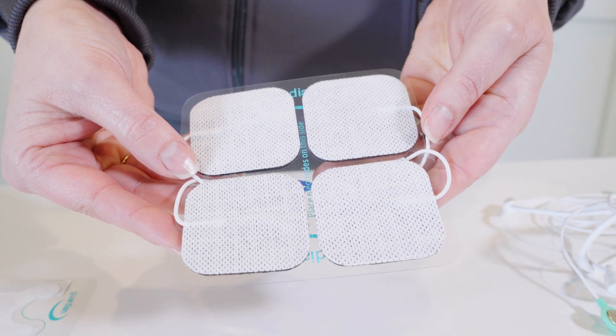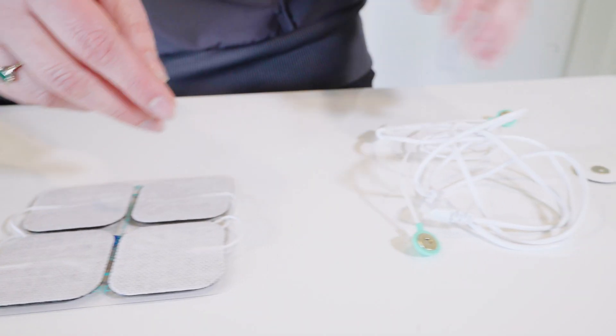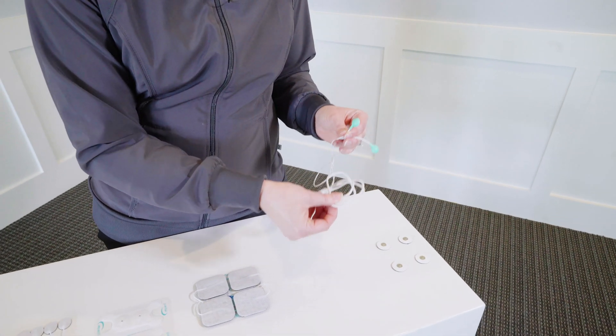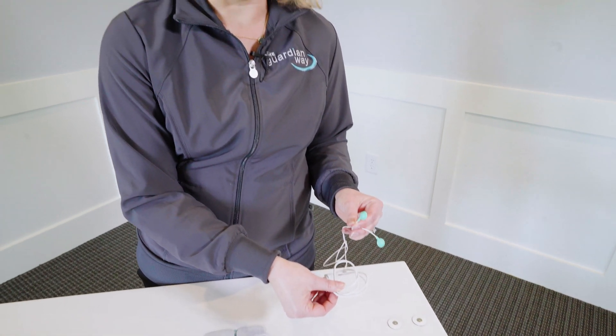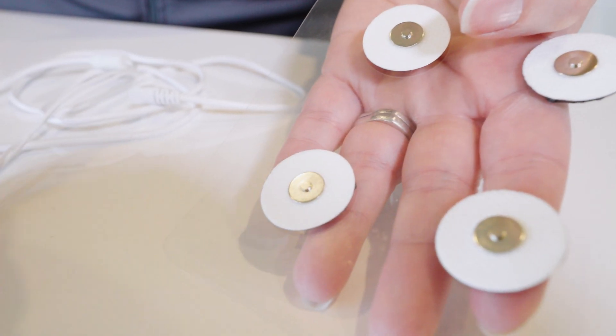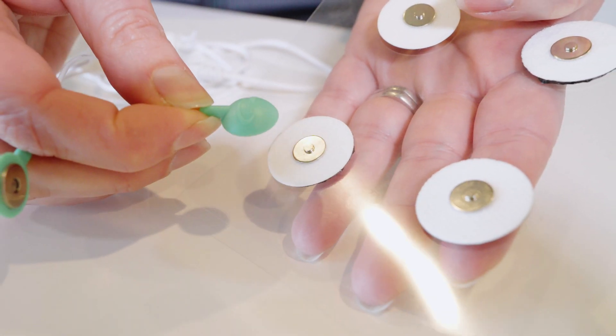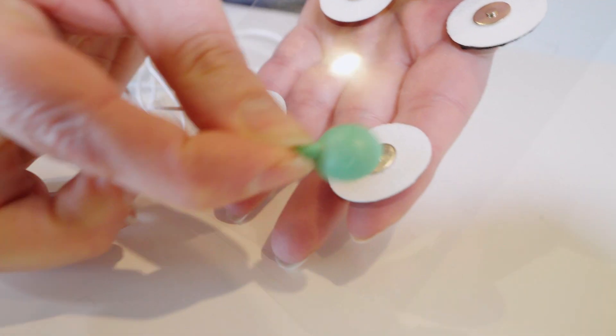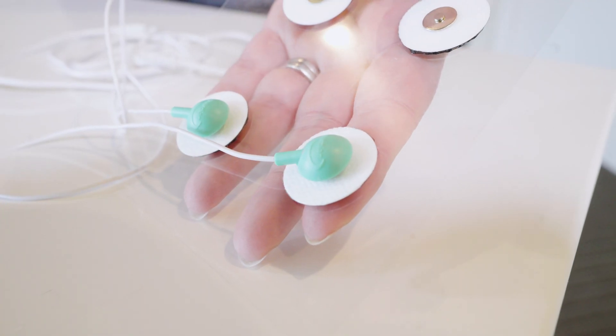We want to introduce our new system for magnetic connections. We have lead wires available for multiple different devices on the market today, and I want to show you how easy these connect. You'd place your electrodes on the patient and simply get that lead wire close, and it snaps right on due to the magnet.